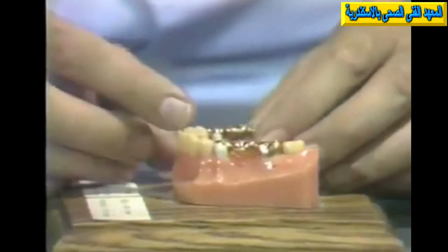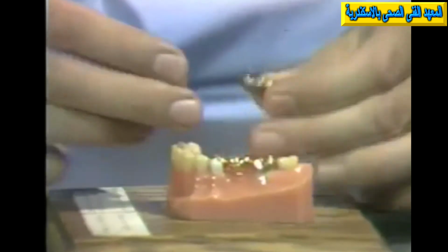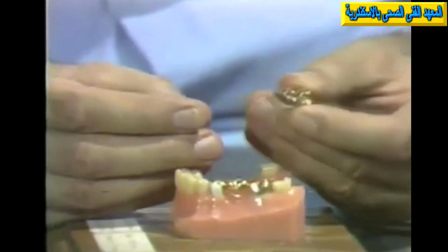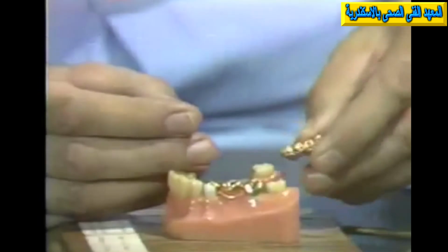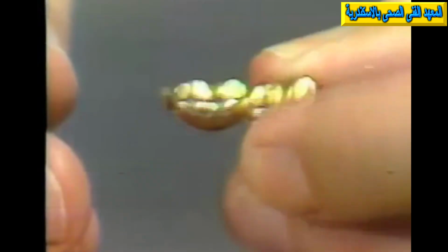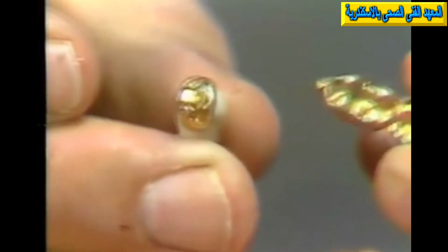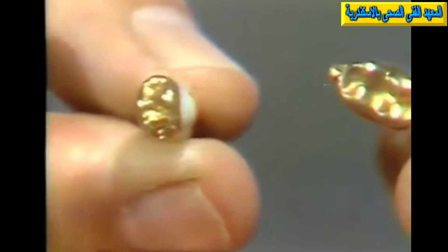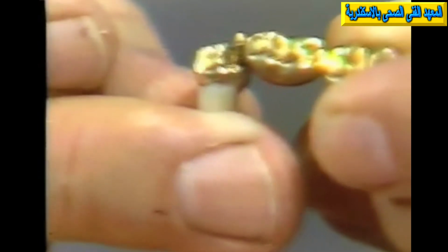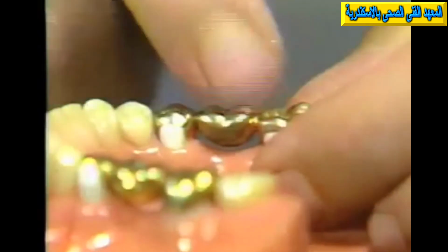It may be helpful at this point to return from the enlarged diagrams to the original natural size model with which we started. And we have here the pontic with its key just on the end. I think I can hold it so that you can just see that key on the end. Notice the length, the retentive form seen from the occlusal. And then we have the other retainer preparation here with the facing and the keyway cut into that. You can see the retentive form there, and of course these two fit together to give the 3-unit bridge with a semi-rigid connector between the molar and the bicuspid.